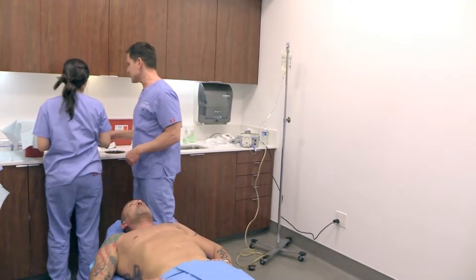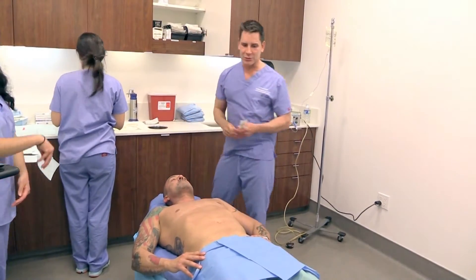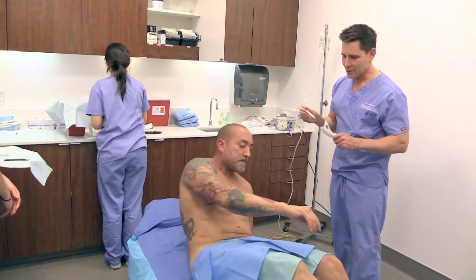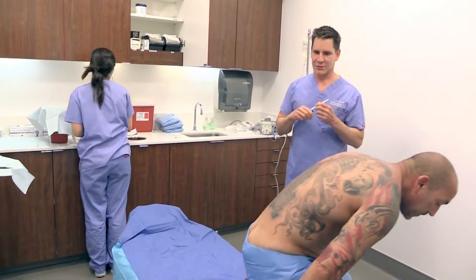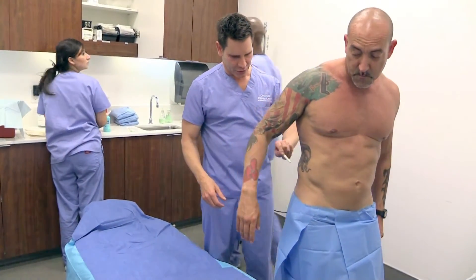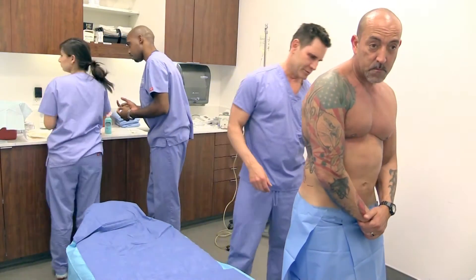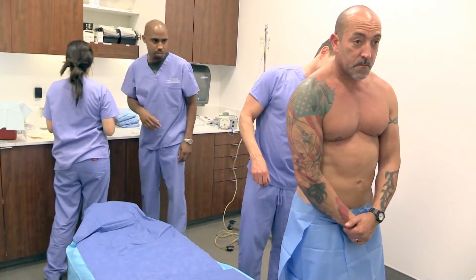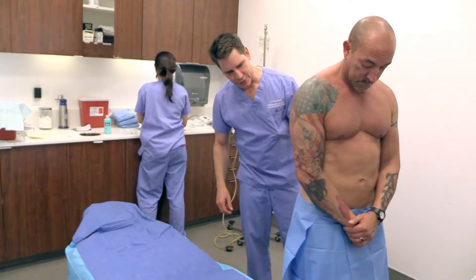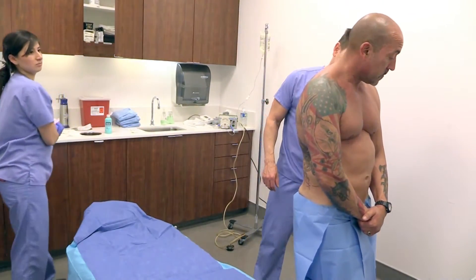Everyone else I've ever worked on has lots of areas you can harvest from. So the first thing we're going to do is wipe them down and cleanse. So there's a little bit of love handle here, and this is the area that we're going to try to harvest. The next thing we're going to do is make some access points to harvest the fat — I'm just going to mark one access point for them.